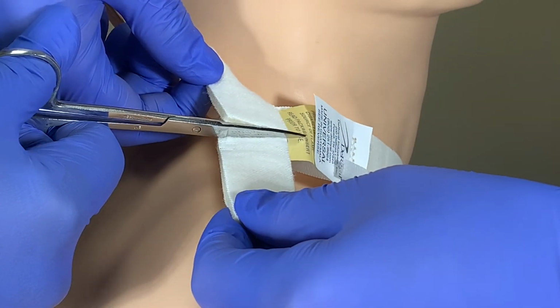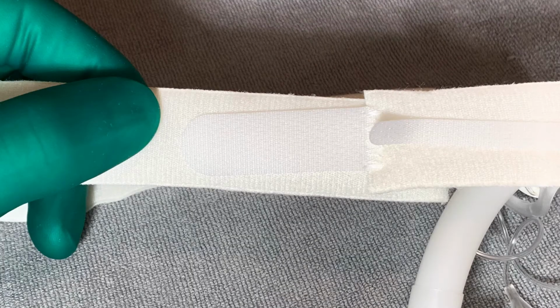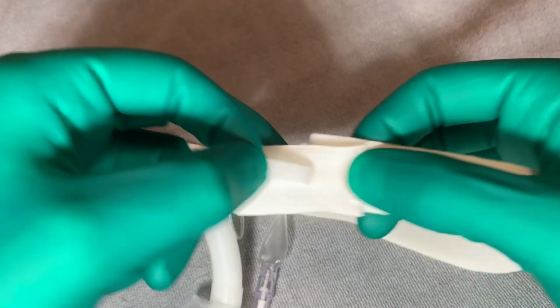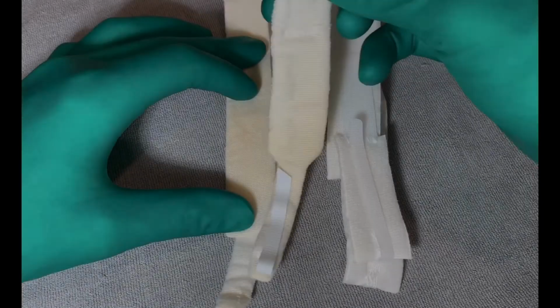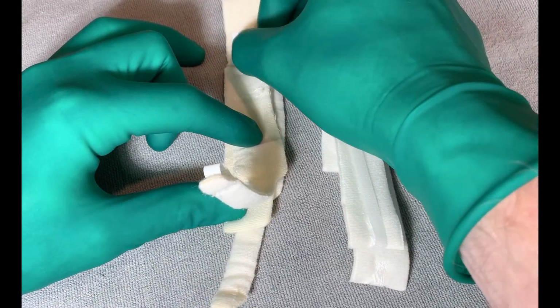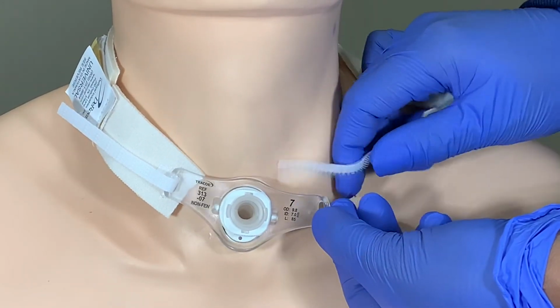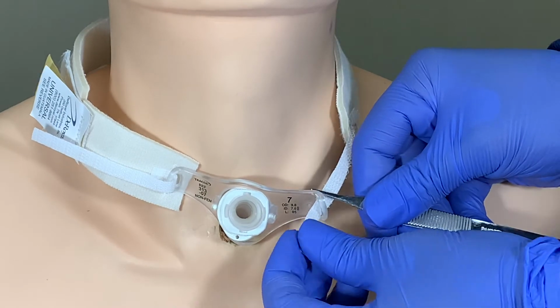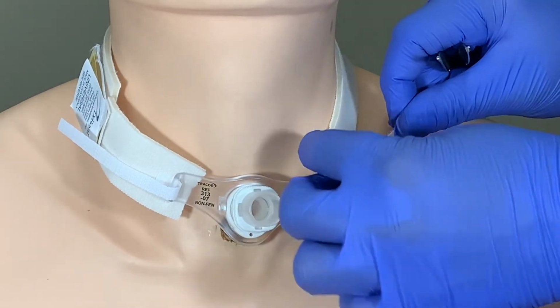While there usually is a larger Velcro strap to undo on the tracheostomy tie, leaving this one in place and undoing the 2 smaller ones at the front can help you keep the tie the same size for your neck. You can use the old one as a guide for the size of your new one. The Velcro can be difficult to thread through the tracheostomy flanges at the front, particularly if you have problems with dexterity. Keeping a pair of tweezers on hand can help with this.